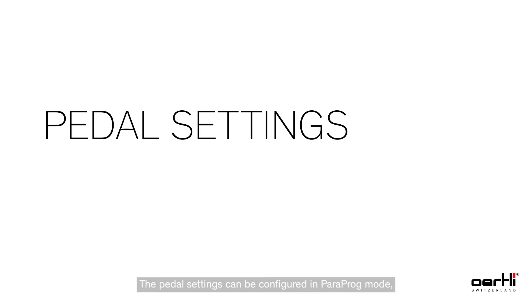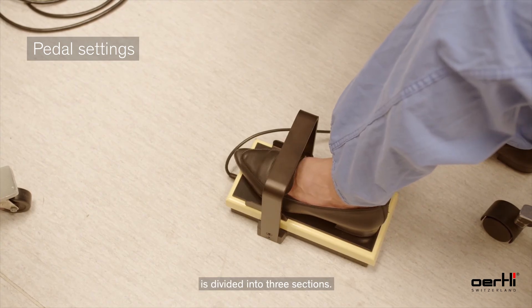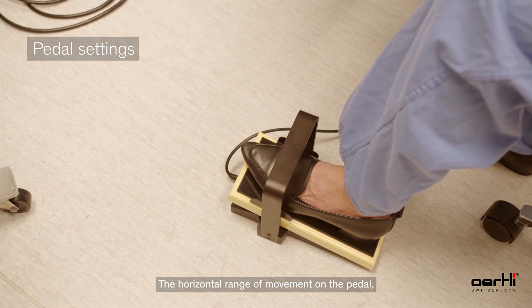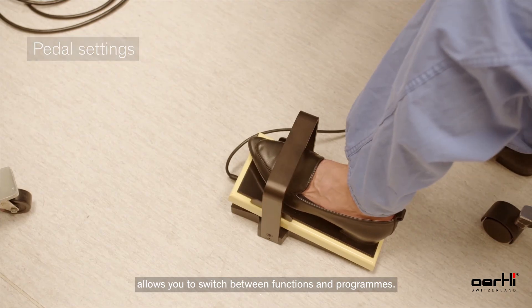The pedal settings can be configured in ParaProg mode individually for each surgeon. The vertical range of movement on the pedal is divided into three sections, from 0 position to fully depressed. The horizontal range of movement on the pedal allows you to switch between functions and programs.